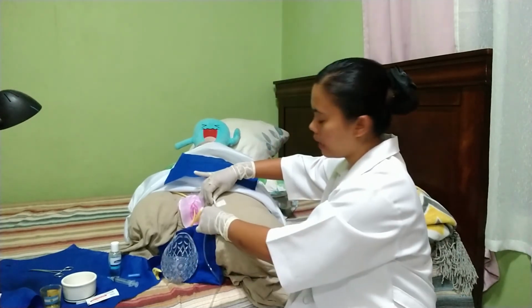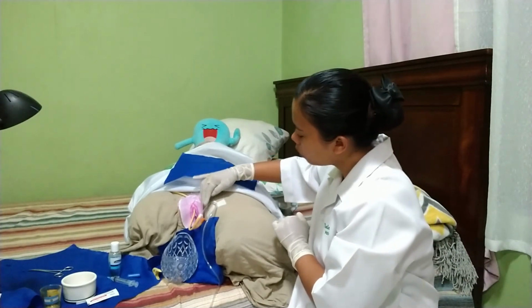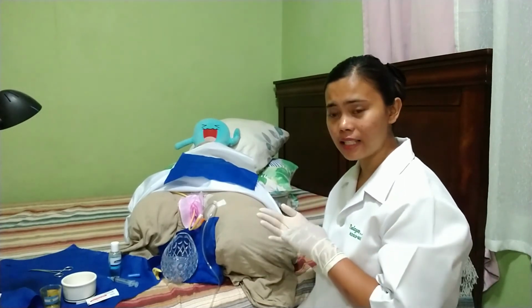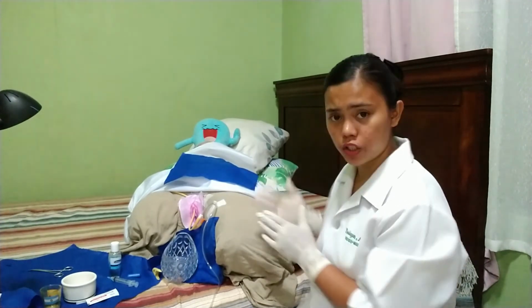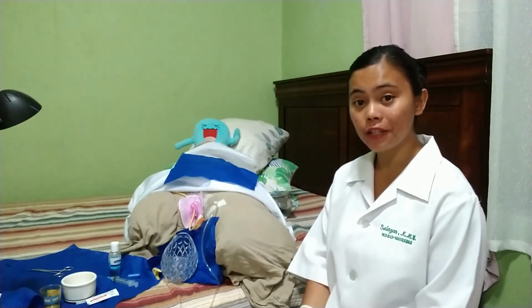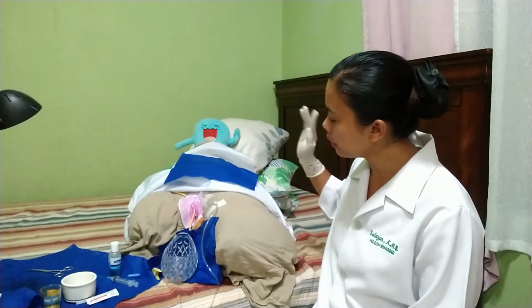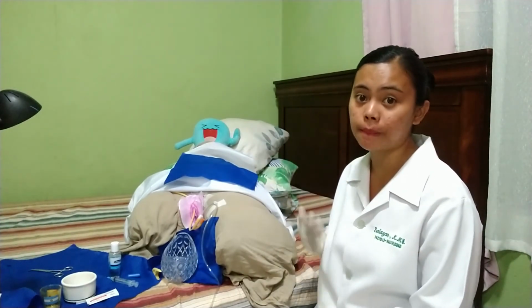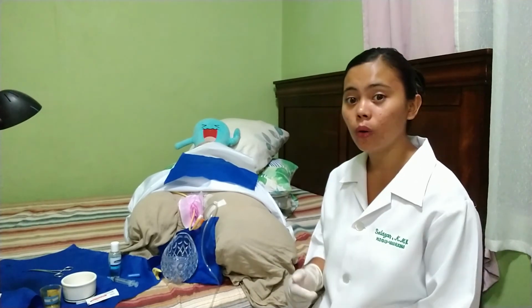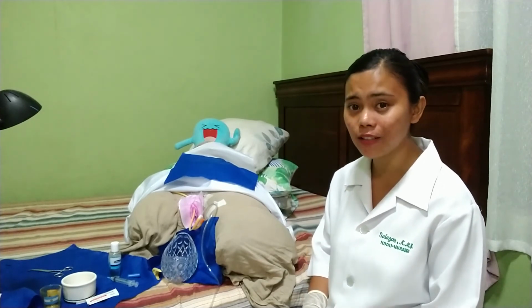So it has to be taped this way. This method of taping it will allow movement. And remember that we have to leave a slack in for additional movement to avoid it from being dislodged when the client is moving. For our female client, we may anchor the catheter tube on the inner side of the leg or the upper leg, while for male, we may anchor the tube on lower abdomen or the upper thigh. And remember to leave a slack in for movement.